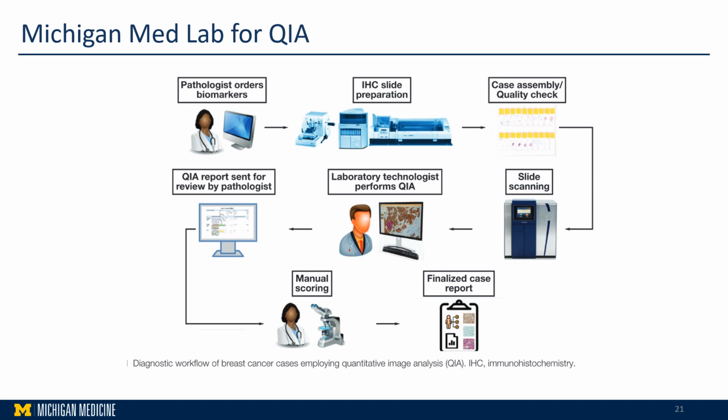The prepared case undergoes assembly and a thorough quality check to ensure accuracy before it's scanned using the Roche Ventana system, and post-scanning these cases are managed and transferred to the technologist who uses software to perform quantitative image analysis, generating a report which is forwarded to the pathologist who initiated the order.